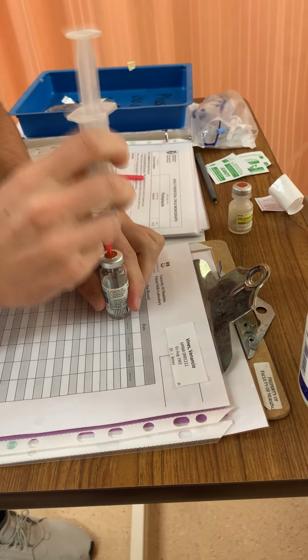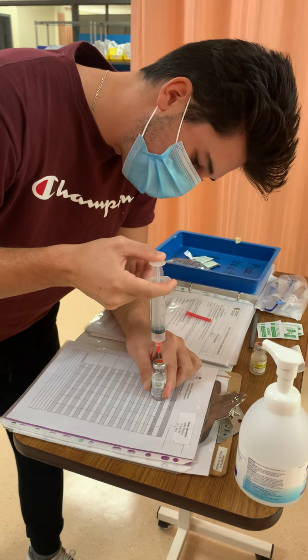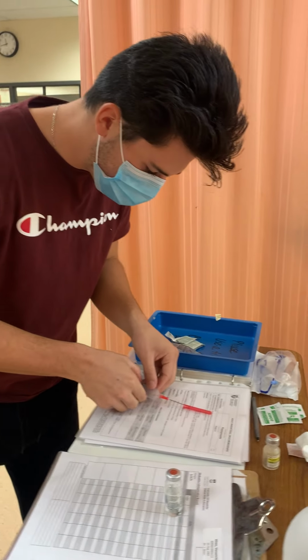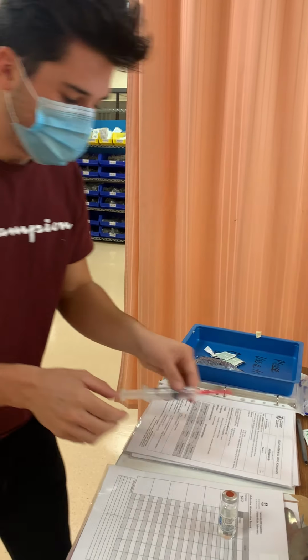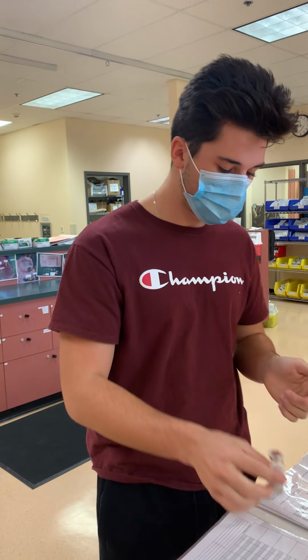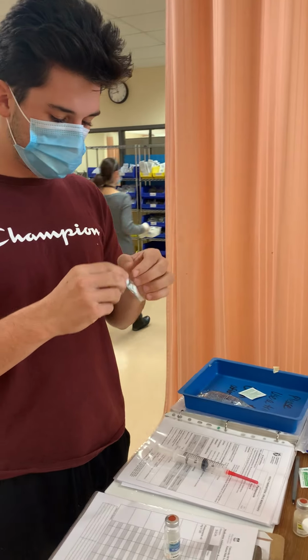So I'm going to inject it, and then pull up my air. Once I've pulled up my air, I can just go ahead and recap my medication syringe. Now I'm going to roll my medication, ensure that it's mixed and there's no sediments left. I can see that there's no sediments, so it's good. And I'm going to swab the top of the vial one more time, just in case I touched it while I was rolling it.